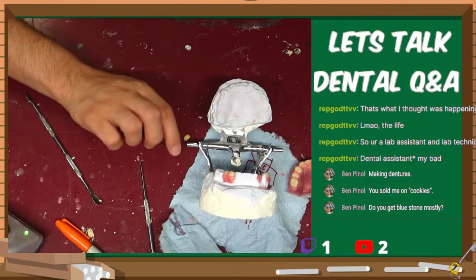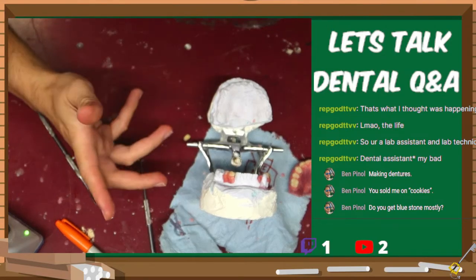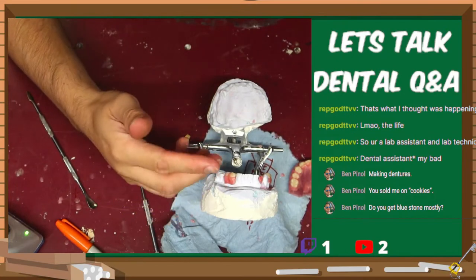Usually if I get the impression, I like pouring it in bluestone because I like the blue. But it really doesn't matter. It's the same exact stuff as the Yellowstone. I just have the blue version.